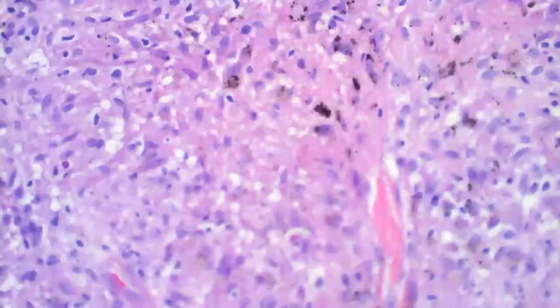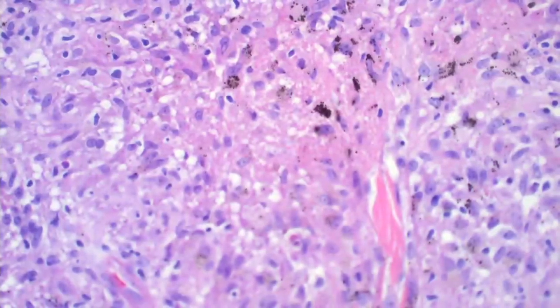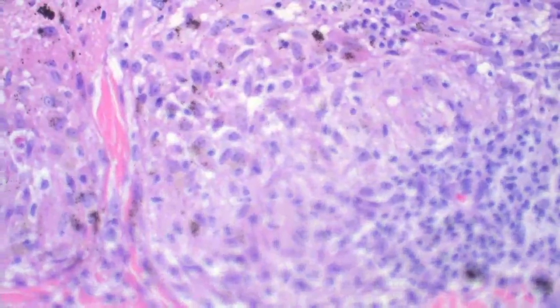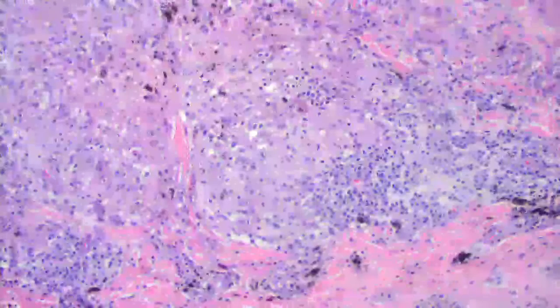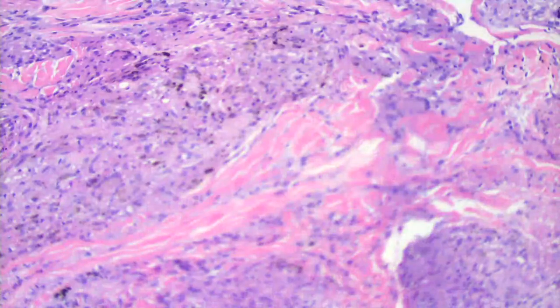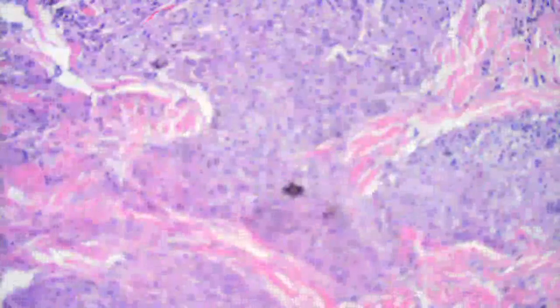What are some other tattoo pigments that you have to know about? Well, other colors, you would recognize them, but you probably want to recognize them on cells as well. It looks a little different. Other foreign body materials that are dark, you probably want to recognize the dematiaceous fungi that produce pigment.